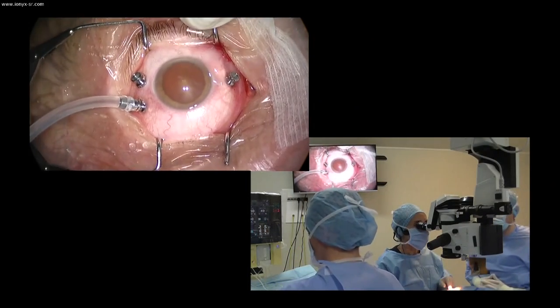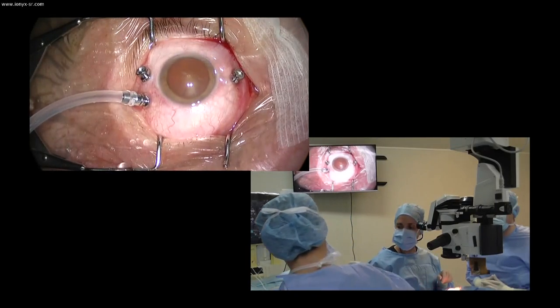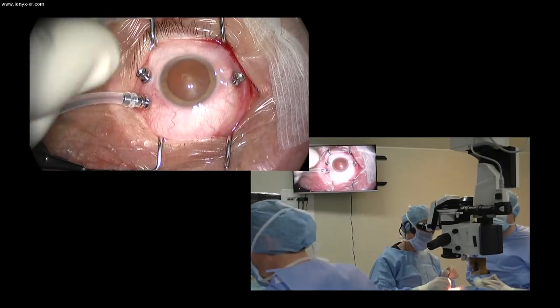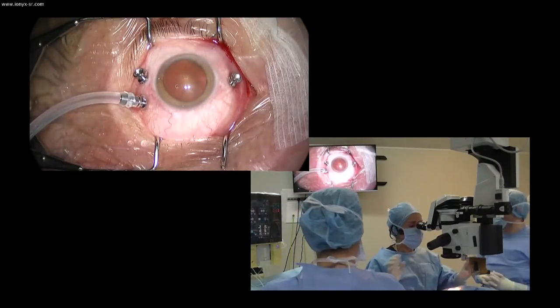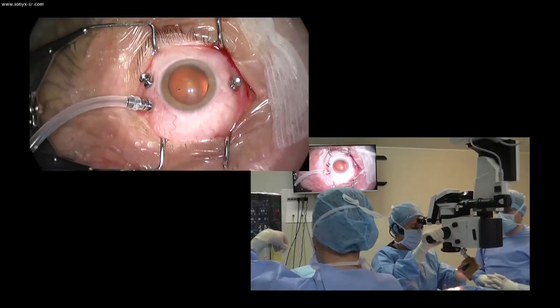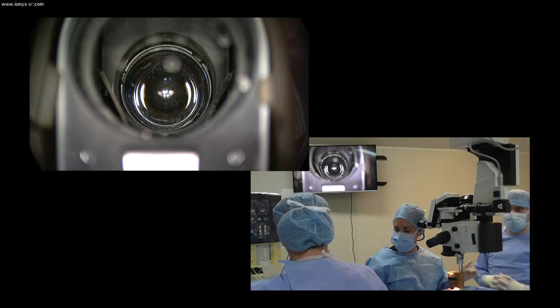So the surgical maneuvers we will perform are vitrectomy and peeling of a specific epipapillary membrane, which is glial tissue based on the histopathologic result of these colleagues. We will try to stain it to better visualize it with brilliant peel and lutein with a double dye.